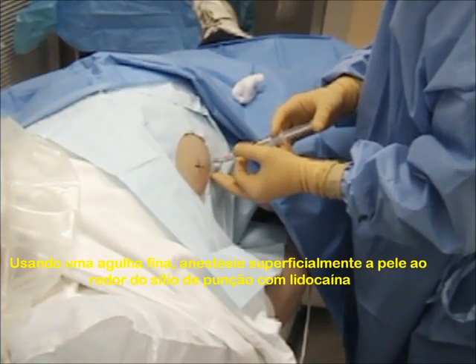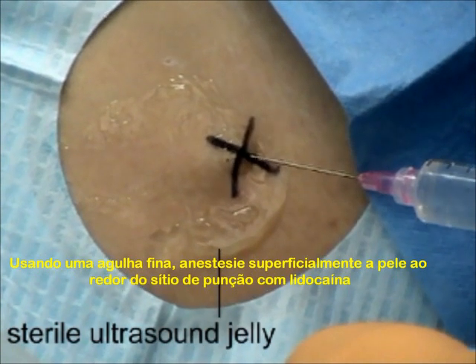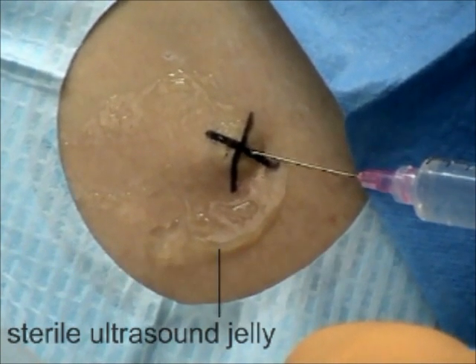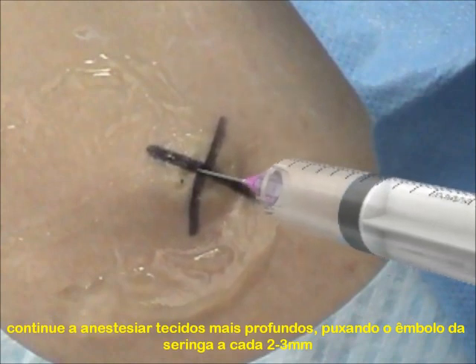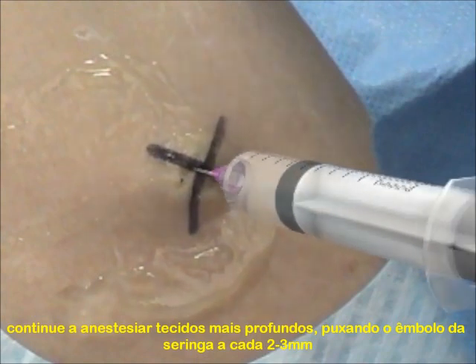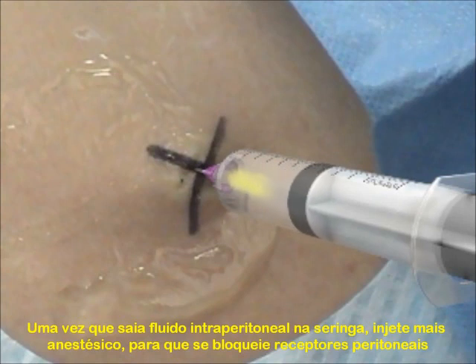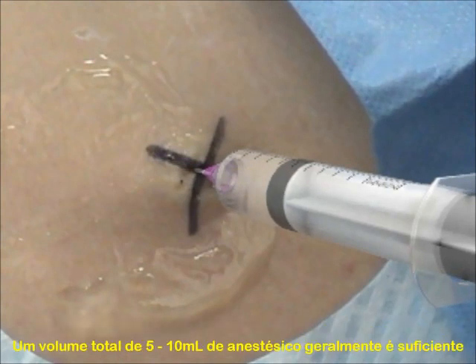Using a 22 or 25 gauge needle, anesthetize the superficial skin with a wheal of local anesthetic such as lidocaine. Continue to anesthetize the deeper tissues in the anticipated tract of the paracentesis catheter, intermittently pulling back on the syringe every 2 to 3 millimeters. Once peritoneal fluid begins to fill the syringe, inject additional anesthetic to anesthetize the highly sensitive parietal peritoneum. A total of 5 to 10 milliliters of lidocaine is generally used.